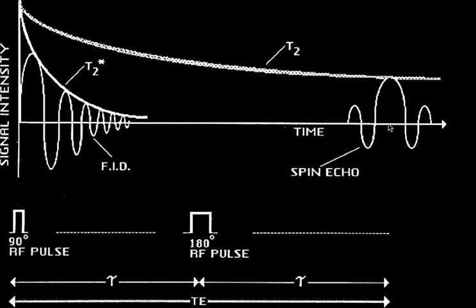Remember, the reason why you have a non-zero bulk magnetization vector in the XY plane is that the nuclei are spinning around with the same phase. Once they become out of phase, then the XY component of the bulk magnetization vector is zero. The individual spins keep spinning around at the Larmor frequency, but they add up to zero so that there's no bulk magnetization vector.